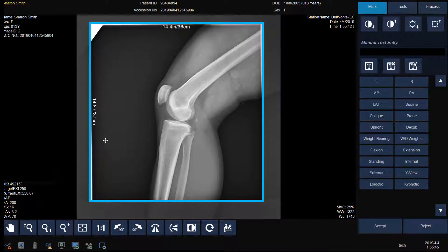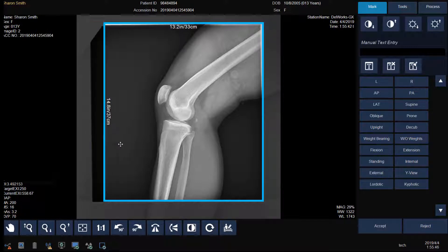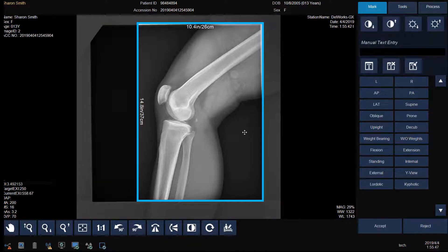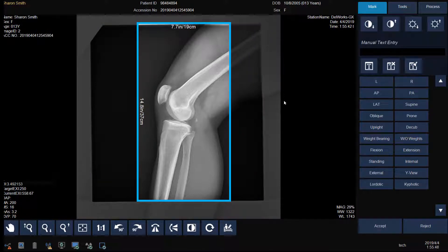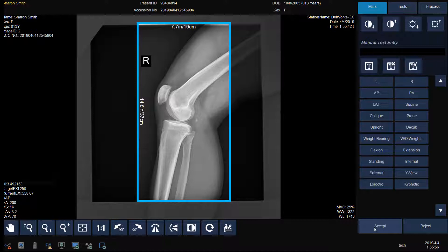Adjust the shutter by dragging the blue box in or out. Add a marker if necessary by clicking on the marker and positioning it on the image. Then click Accept to move on to your next view, or click Reject if you want to repeat the view.